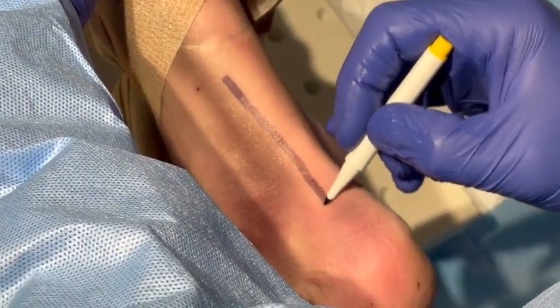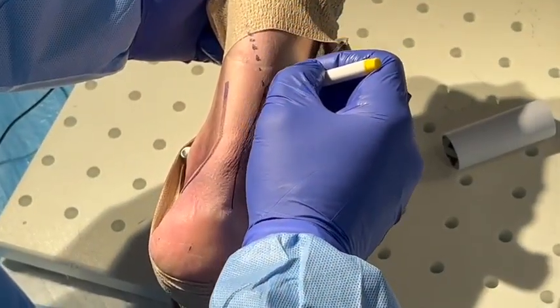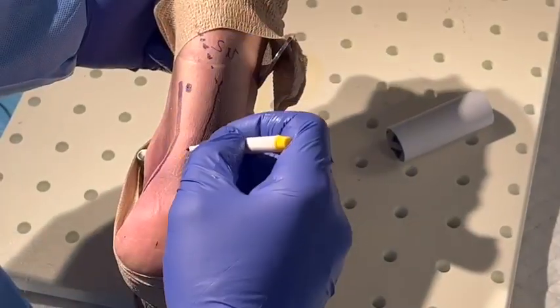With the use of a sterile marking pen, the relevant anatomical landmarks are identified and marked out, including the medial and lateral borders of the Achilles tendon, the sural nerve, and the proximal medial and distal lateral portals.